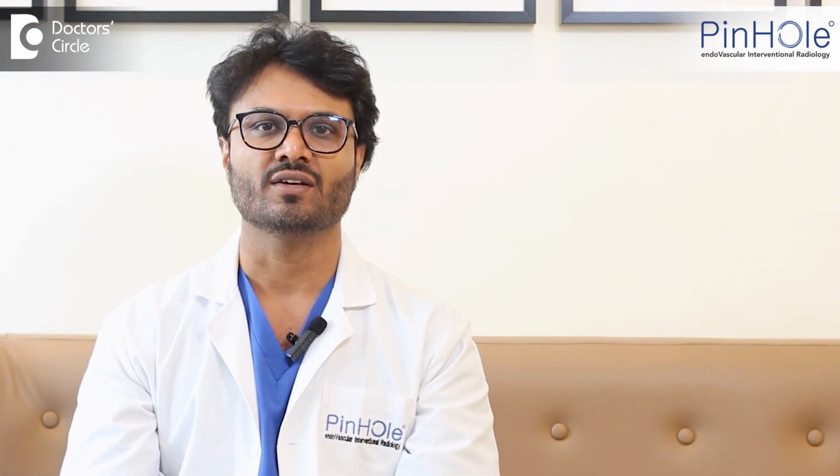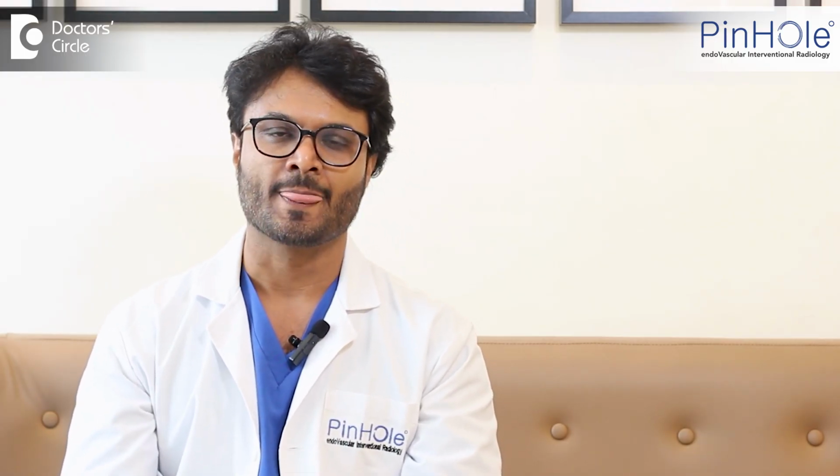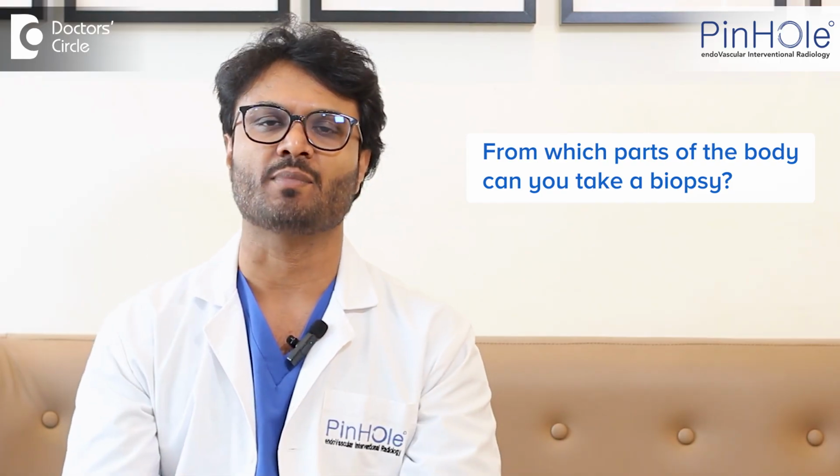The patient comes after 3 to 4 hours of fasting with a few blood tests done prior, wherein we know the blood is thin or thick, how much are the platelets, PT, INR, all these are documented, and the patient is counselled and consented. The procedure usually takes 20 to 30 minutes, wherein we go into the target area and take the biopsy. So, which are the areas we can take biopsy?